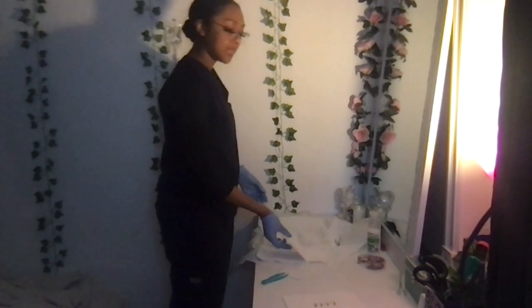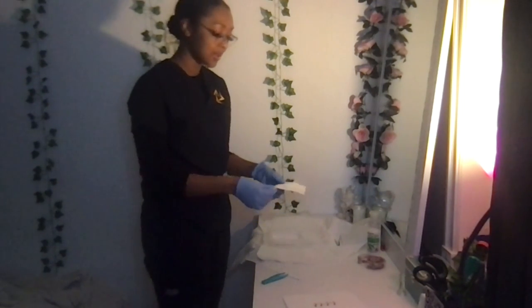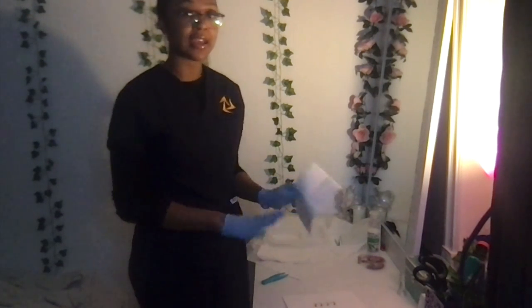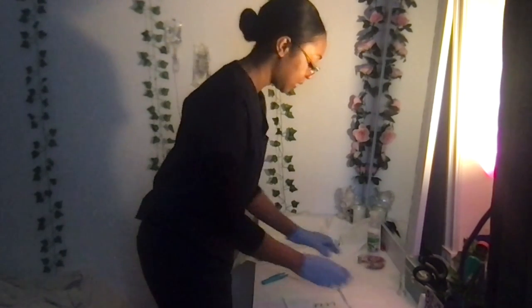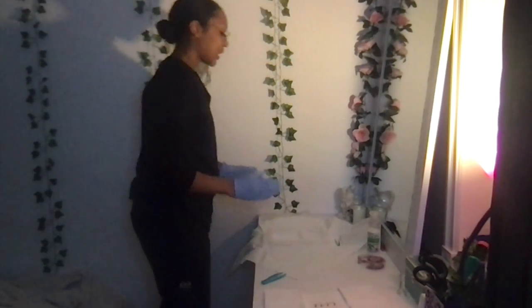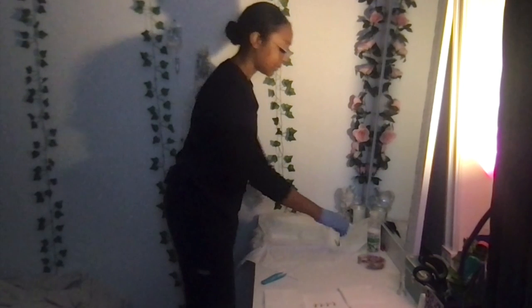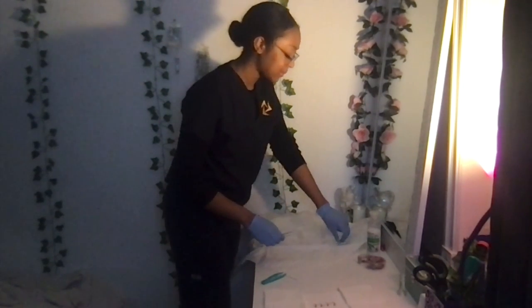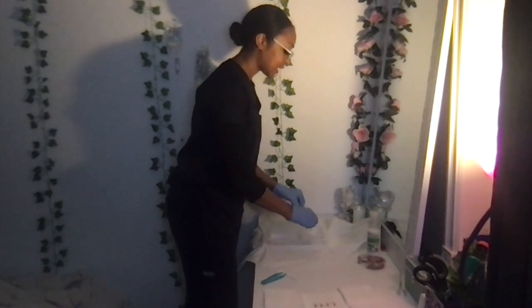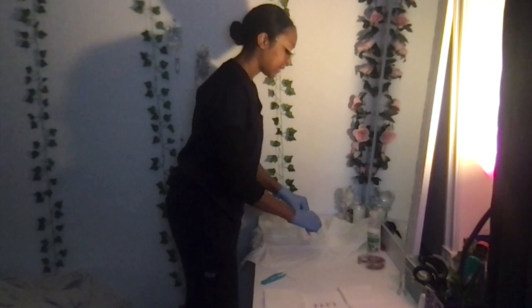So I would drape the patient, but since these are too big to fit on my desk, then I'm just going to verbalize it. Once I open this, there is going to be a matte side and then a shiny side. I would place it shiny side down. And then I can prepare cleaning of the wound. So I will take my gauze and I will put them into the sterile solution and wring them out with my tweezers to prepare for the cleaning.